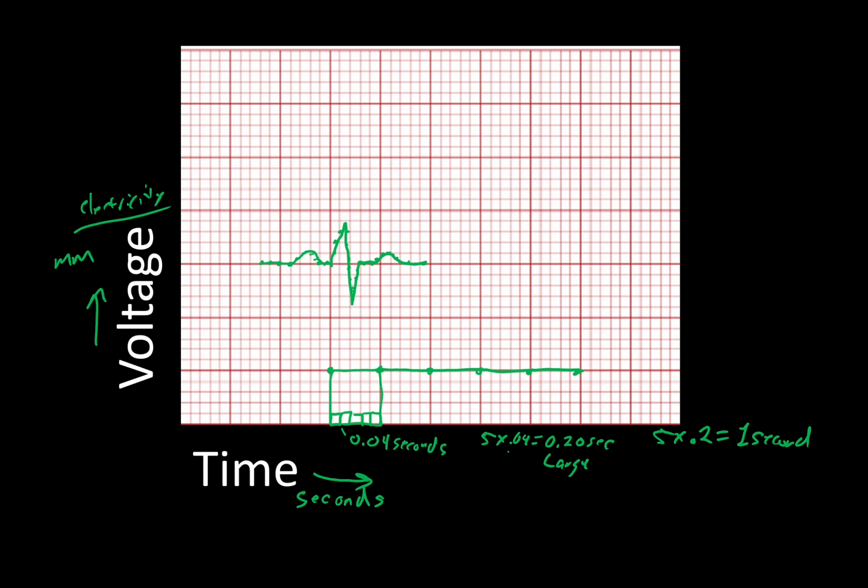And so you can see how, granted, my numbers are not perfect by any stretch of the imagination, but it demonstrates the idea that if I have anything that looks different, I can easily say the electricity flowed away, came back to nothing, flowed towards it, less, now the electricity is flowing away, comes back, a little more electricity than our baseline, and then there was some, and then back down to 0 again.